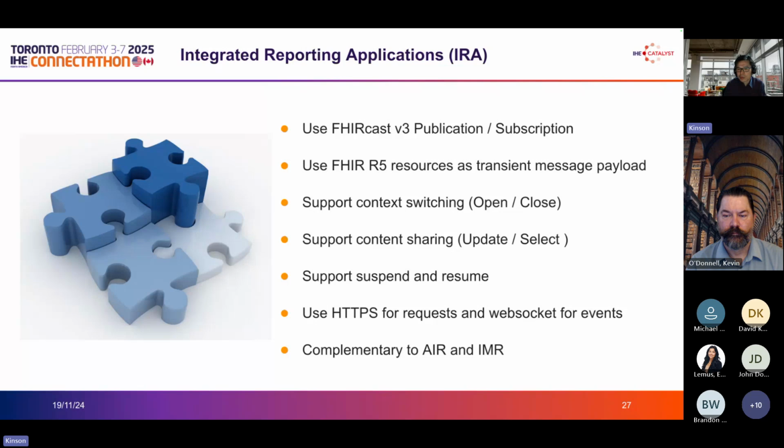I'll talk about more details about that specific use case. It's a very interesting use case. How can you select? I mentioned how the profile also supports suspend and resume. It has specific requirements on the system so that when you resume, you're required to bring the state of the system back to the same state as when it was suspended.